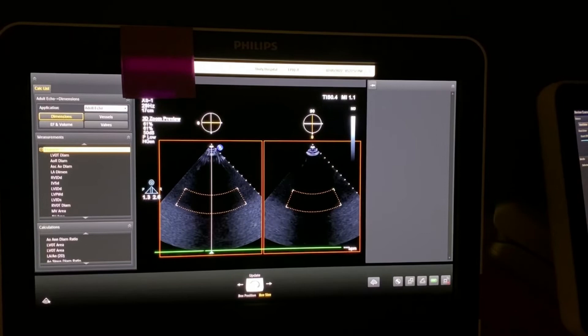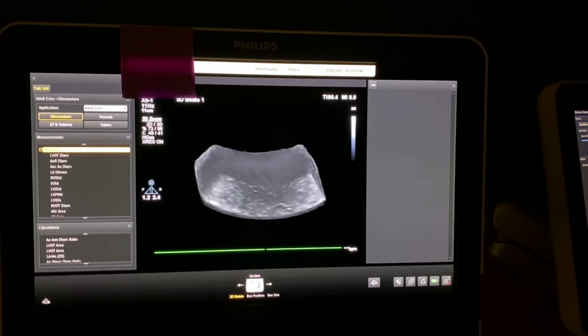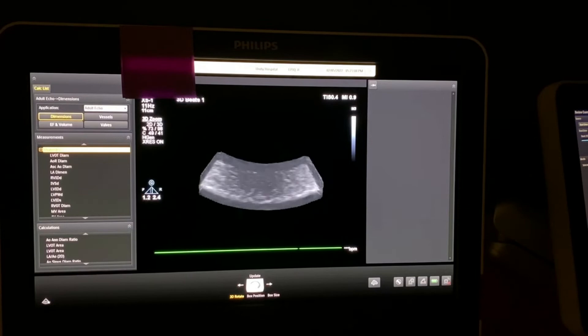So if we hit the 3D zoom button again, you get this wedge. Now usually it kind of looks like this when you first acquire it.